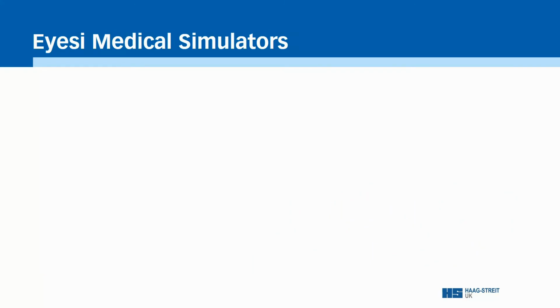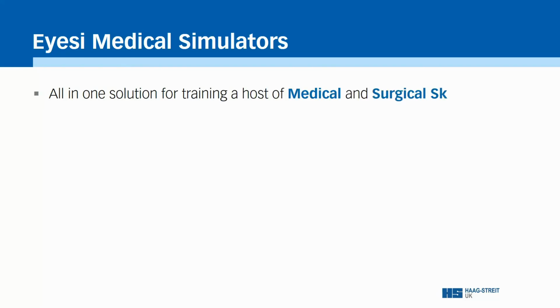I hope this presentation has given you a taste of just how remarkable the Eyesi simulator range and the slit lamp simulator in particular really are. Just to recap some of the key points. The wide range of Eyesi simulators offer extensive risk-free training for a host of medical and surgical skills without the need for a willing but nervous patient or altruistic colleague.